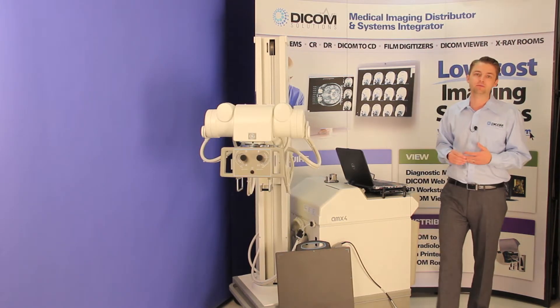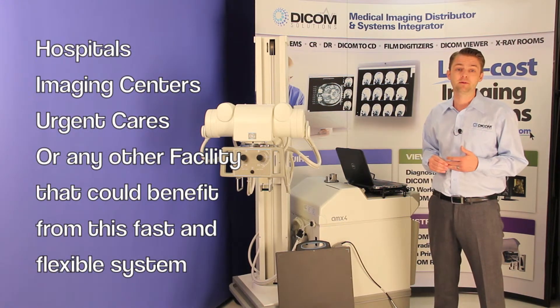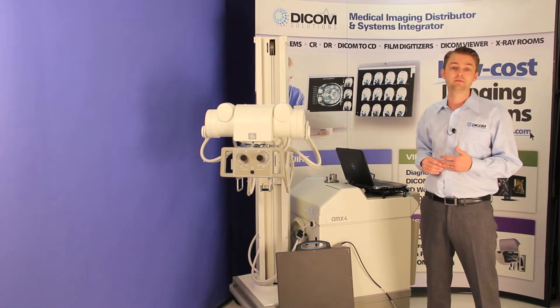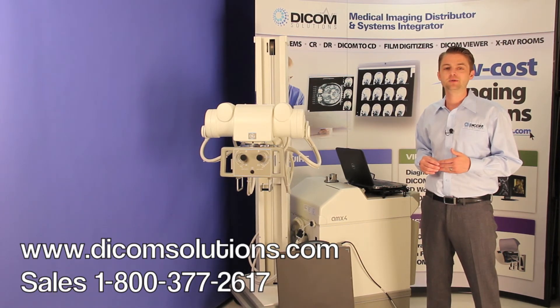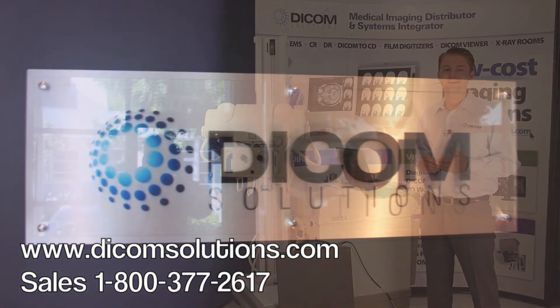This solution is great for hospitals, imaging centers, urgent cares, or any other facility that would benefit from a fast and flexible digital x-ray system. This is a great example of a product and we have many more on our website. You can visit www.dicomsolutions.com or give a call to one of our sales representatives at 1-800-377-2617. For any of your imaging needs, always call Dicom Solutions. Thank you.